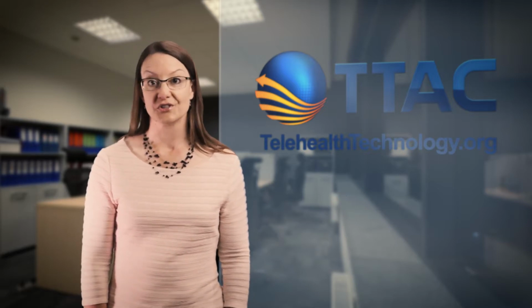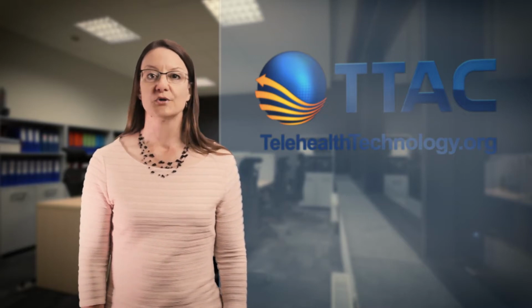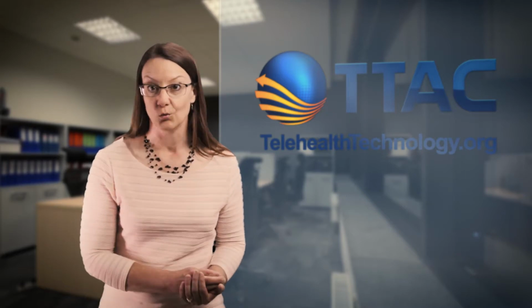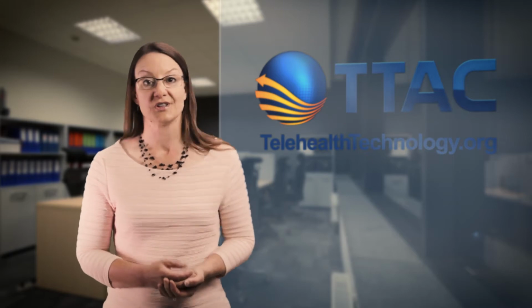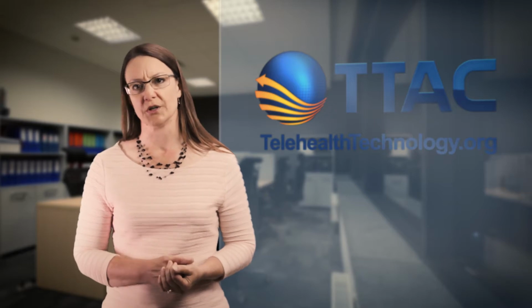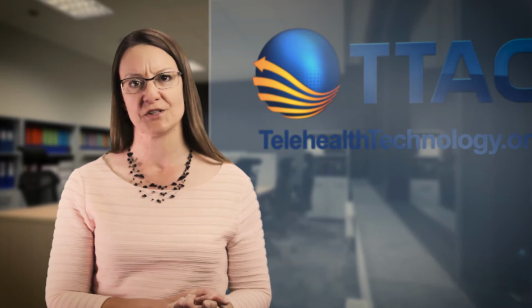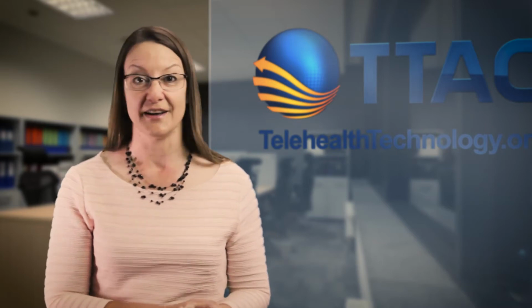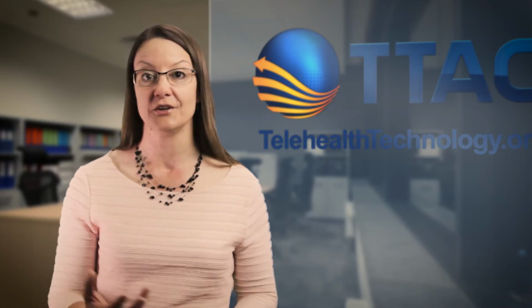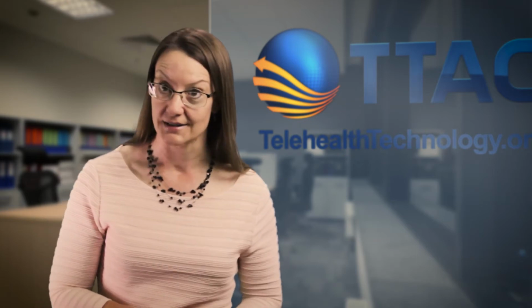At TTAC, we always suggest that you test a device in its host environment before a large-scale deployment. Most vendors are willing to loan you a test model for this purpose, which allows you to evaluate clinical workflow questions, hardware concerns, and networking issues. Also consider some variables that might make a huge difference in what you hear. I've heard of televisits that went wrong because the heart sound was transmitted over a speaker, but sounded fine after headphones were plugged in. This just reinforces the importance of testing what your clinical users will actually do and then training them on recommended best practices.